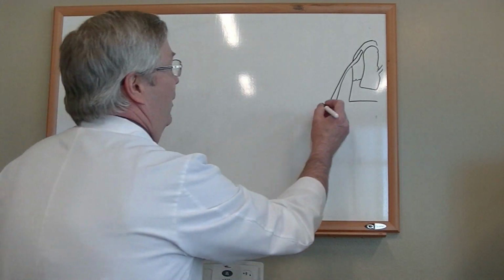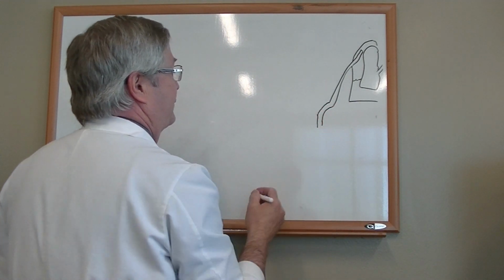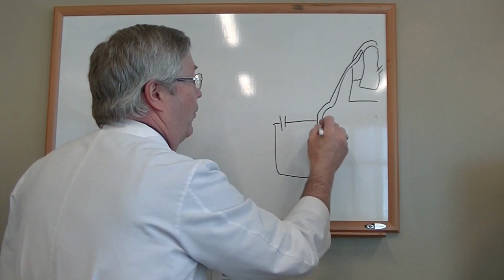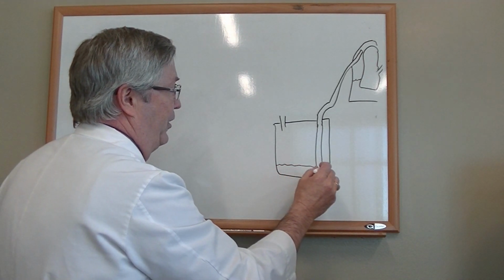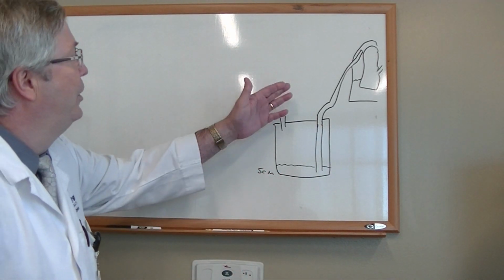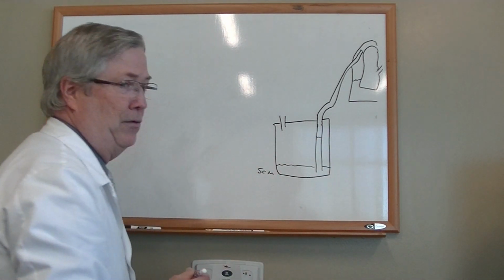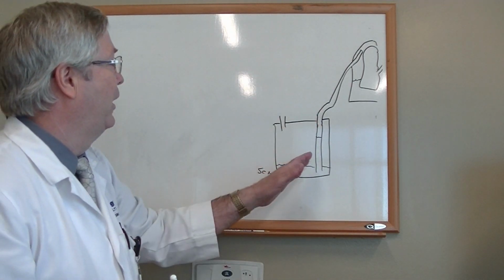Well, long ago, somebody set up what's called chest bottles. In one of these tubes would be in a pool of fluid. This is about 5 centimeters of fluid. Now, when you inhale, it creates negative pressure. It tries to draw this fluid up the channel, but eventually that column of water is too high for the inspiratory pressure of the lung, and therefore air can't get in.